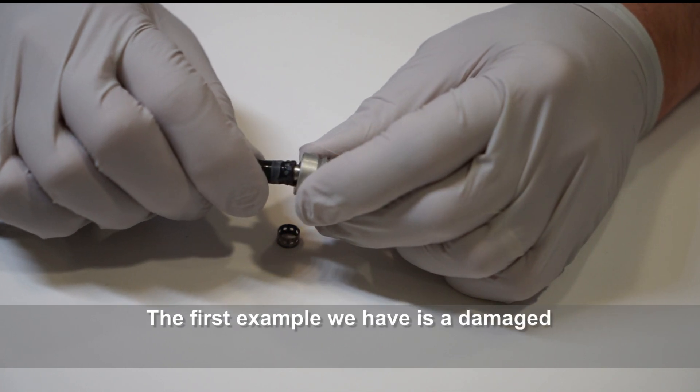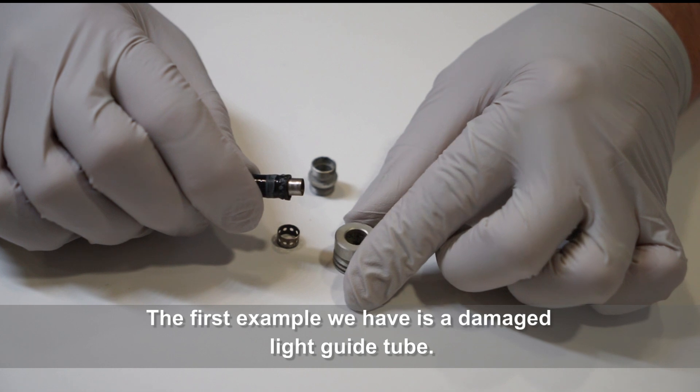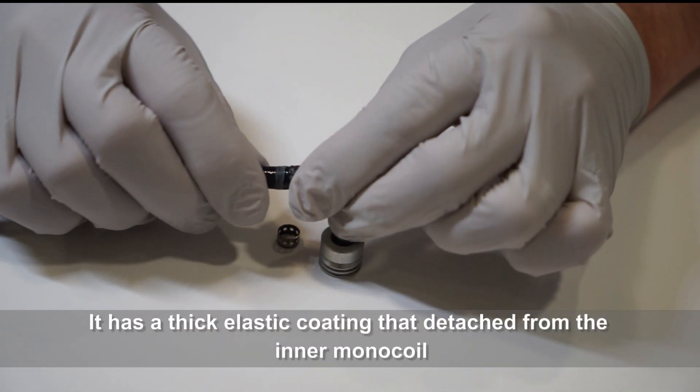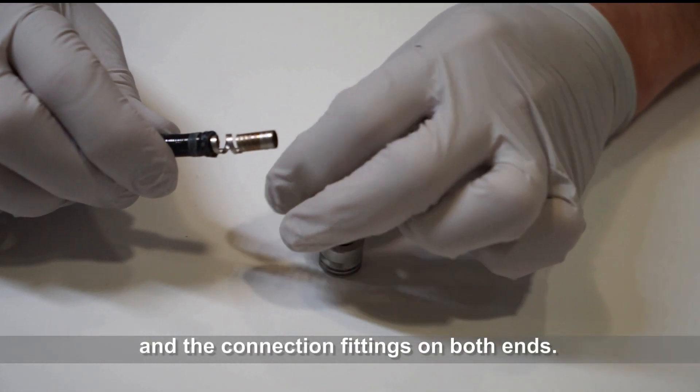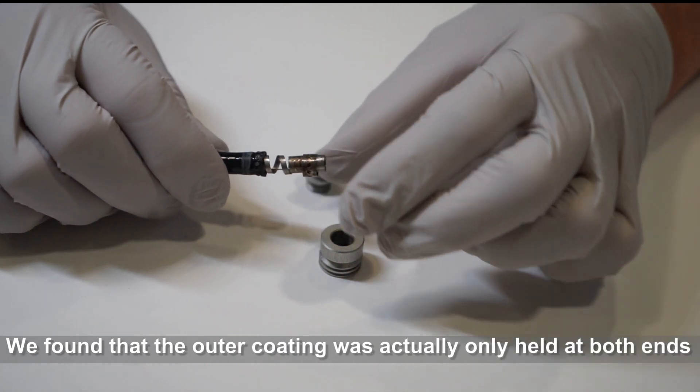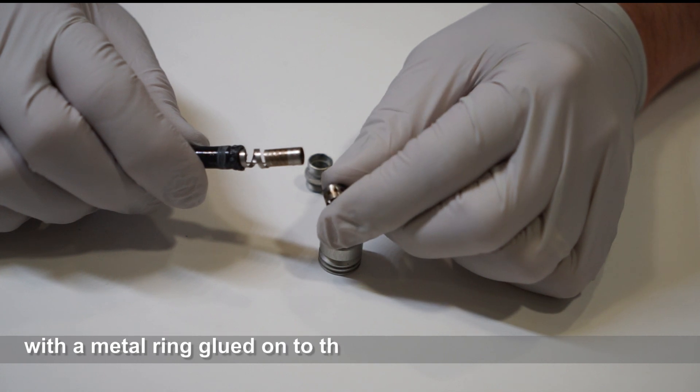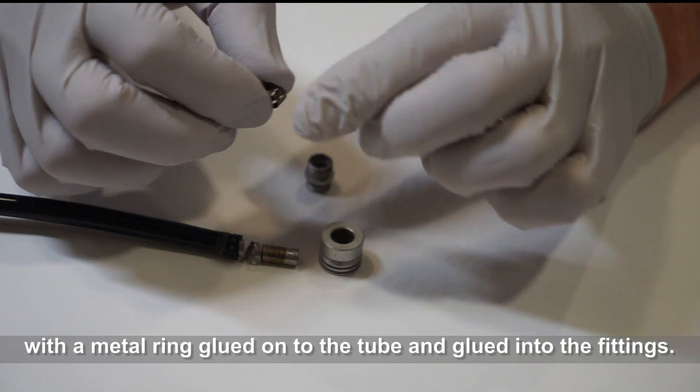The first example we have is a damaged light guide tube from Astoris 11272VN. It has a thick elastic coating that detached from the inner monocoil and the connection fittings on both ends. We found that the outer coating was actually only held at both ends with a metal ring glued onto the tube and glued into the fittings.